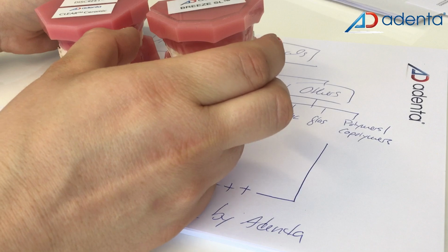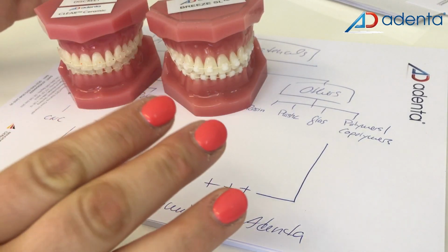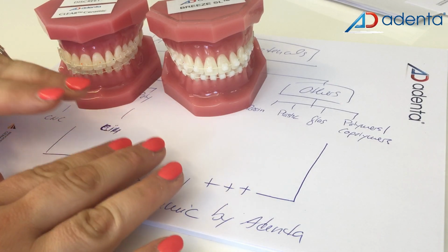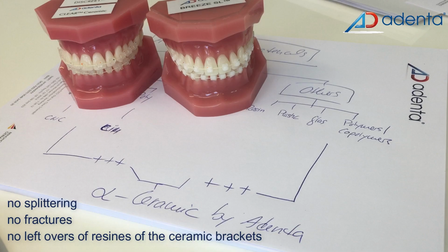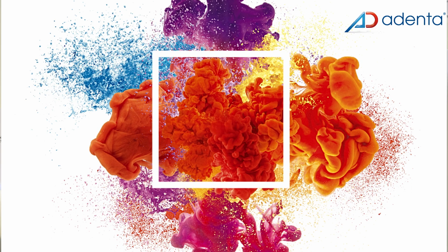This is how you detach the bracket from the enamel, and you don't have any issues with splintering, with fractures, or with spending a lot of time taking your burr and drilling down the residues of the ceramic brackets. This is the brief overview of the aesthetic materials we have available on the market.